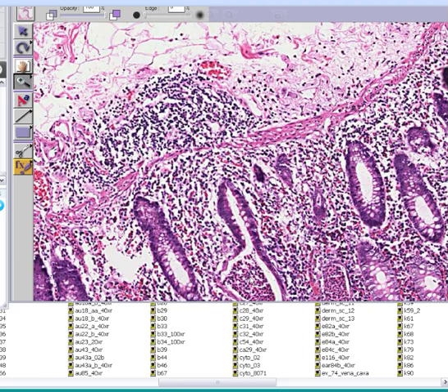Well, what do you call a localized collection of acute inflammatory cells? You call it an abscess, don't you? So this is what they call a crypt abscess, or collection of neutrophils within the crypt. And crypt abscesses are very, very characteristic of inflammatory bowel disease. And they're very, very characteristic of ulcerative colitis rather than Crohn's colitis.